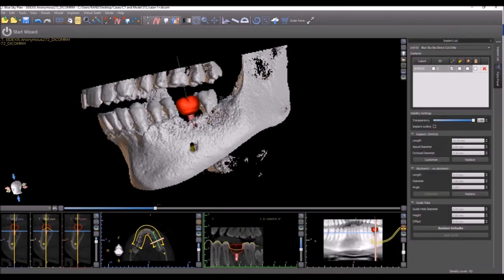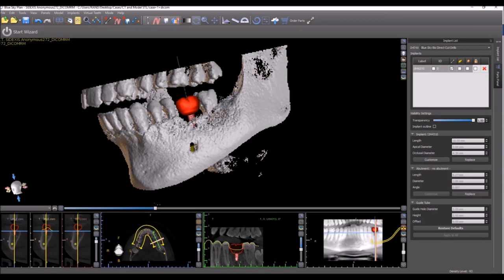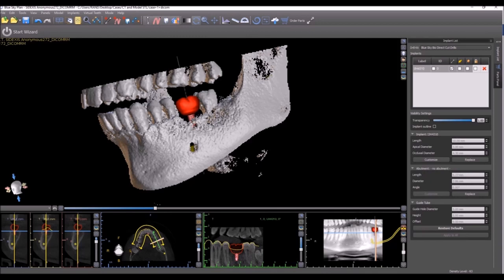As mentioned, this version of the software supports the Blue Sky Bio fully guided keyless surgical kit, which is really a must-have for anybody that wants to do fully guided surgery. So, we demonstrated how to change the setting in the wizard, which is really the easiest and fastest. For users who are not using the wizard, a couple of technical things.